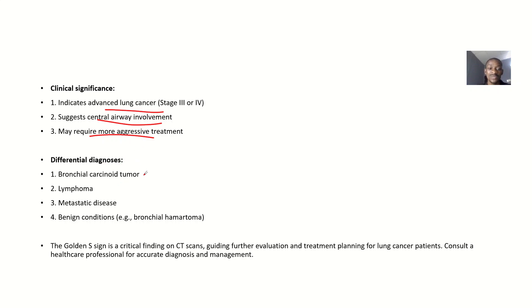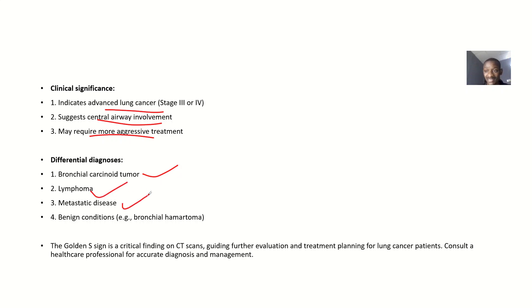For differential diagnosis, the Golden S sign could indicate a bronchial carcinoid tumor, a lymphoma, a metastatic disease, or even a benign condition.